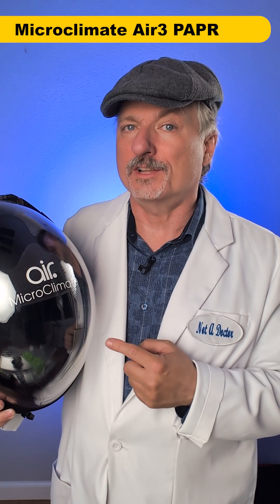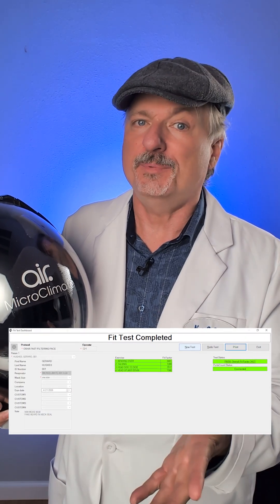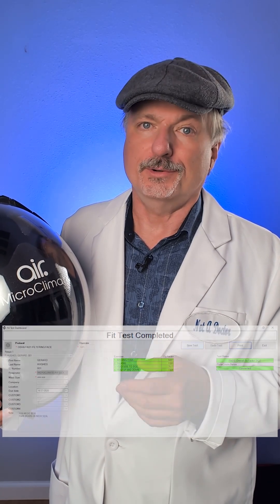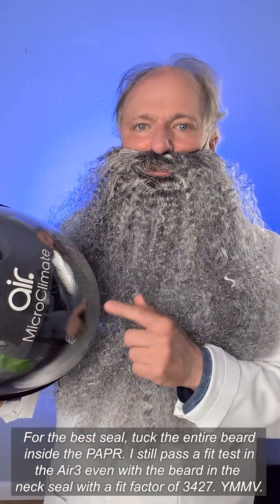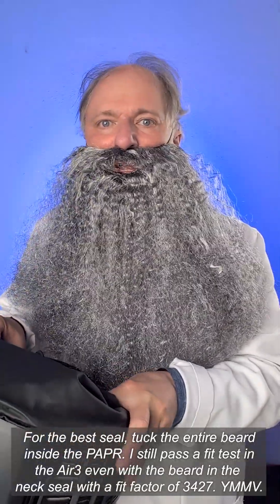But there's an alternative you might like better. This bad boy is a fan-powered respirator. It is a NIOSH approved PAPR-HE and it works great with beards, even if the beard is in the neck seal. I've tested it multiple times with the fake beard and it works with real beards too. To put this on, just turn the fan on, hold the seal open with your fingers and put it over your head.